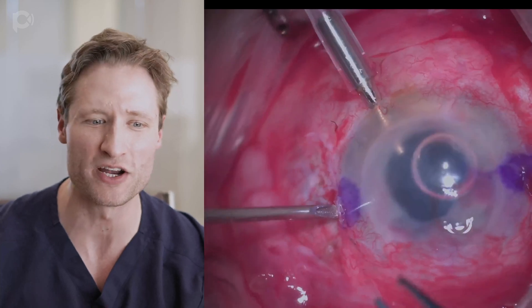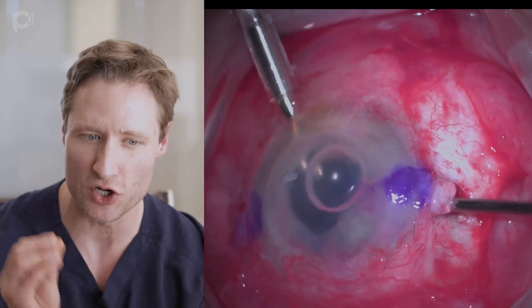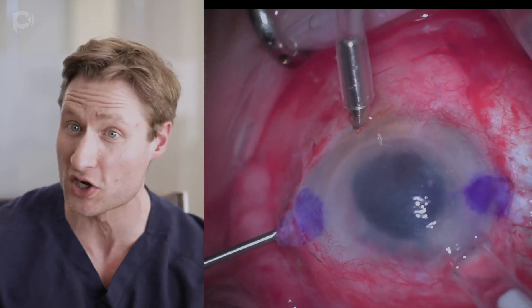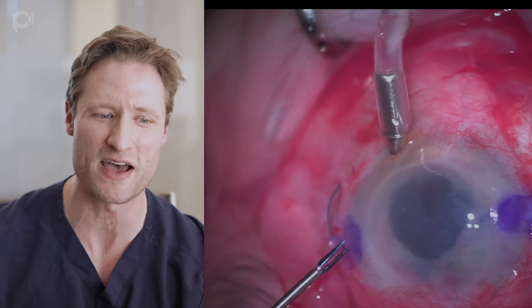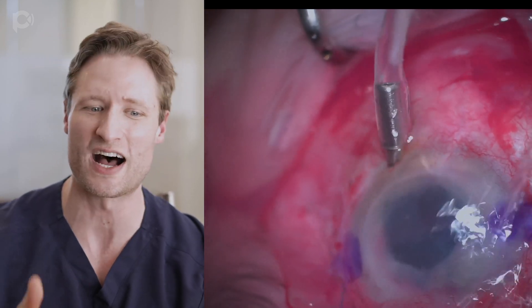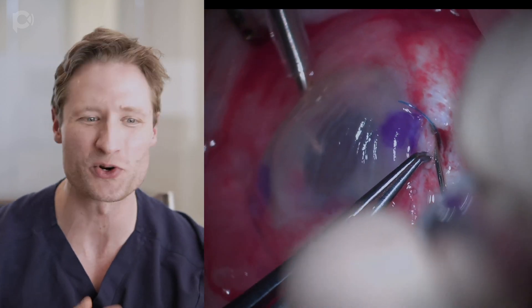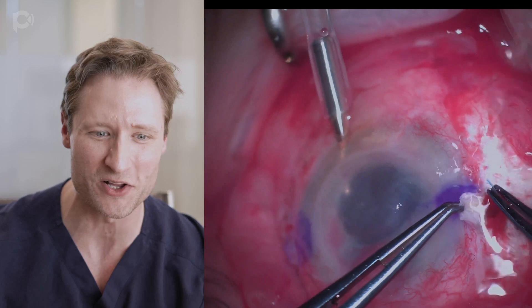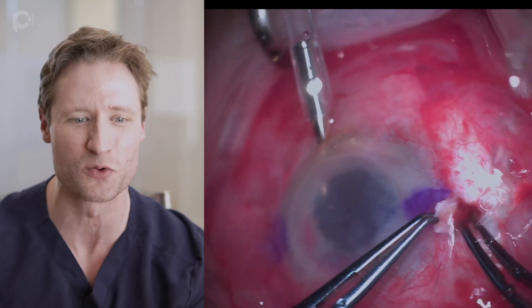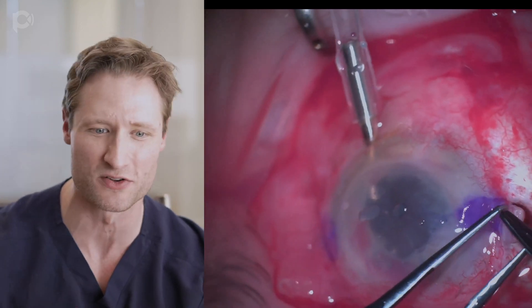If I had to do this operation again, I would not do a combined glued IOL with DMEK. I would just do the glued IOL and do the DMEK later, because this eye has got all these wounds. The eye is soft, which makes graft unfolding much more difficult. The glued IOL technique has been described many times before — basically you insinuate a three-piece lens in the eye and pull the haptics out through sclerostomies 180 degrees apart.